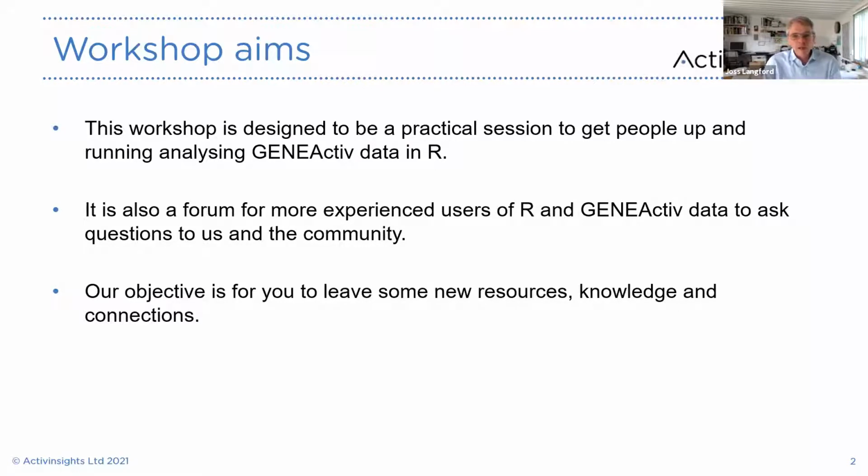The aim of the workshop is for it to be a practical session. We want to get people up and running, analysing GENEActiv in R. It's also a forum for more experienced users of R and GENEActiv data to ask questions of us and of the community, so please don't be afraid to ask other people. If we facilitate a useful discussion amongst the members of the workshop, that's more useful than us just broadcasting. I can see within some of the names that there are some more experienced users here, so don't be afraid to give people the benefit of your experience in this space as well. The objective for us is to leave you with some new resources, some knowledge, and some connections out of the workshop.